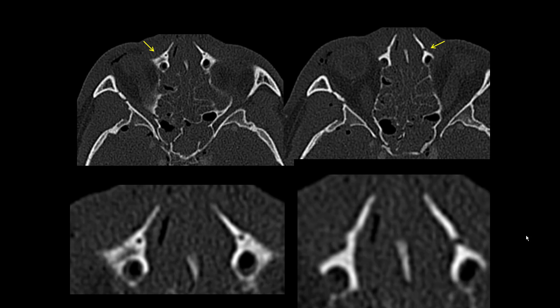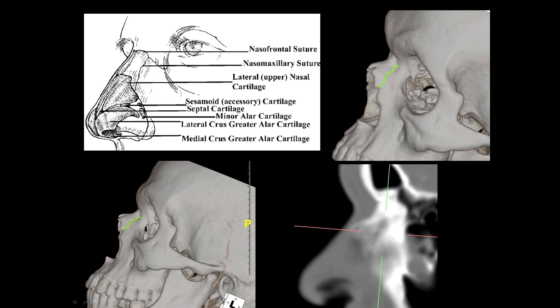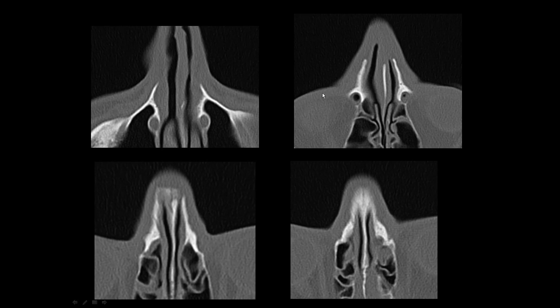Now we're going to talk about nasal bone fractures. In this example, it is not actually a nasal bone fracture — this is the frontal process of the maxilla. I've spoken to plastic surgeons and OMFS colleagues and they sometimes refer to all of these fractures as nasal bone fractures, but technically this is not the nasal bone. The nasal bones are the two most anterior bones. This is the frontal process of the maxilla, and here you have the nasomaxillary groove. The nasomaxillary suture and the naso-frontal suture are also identifiable, and on the 3D images you can see these structures illustrated as well.